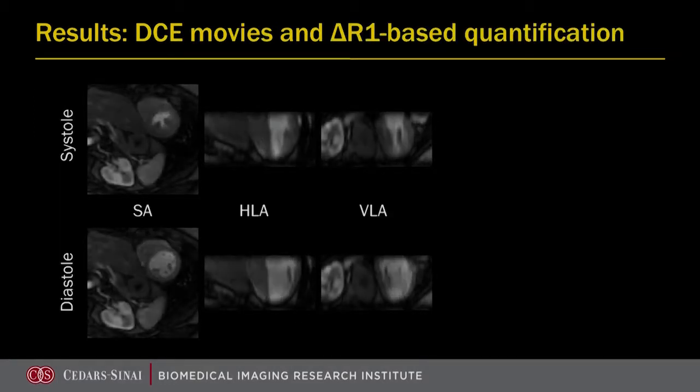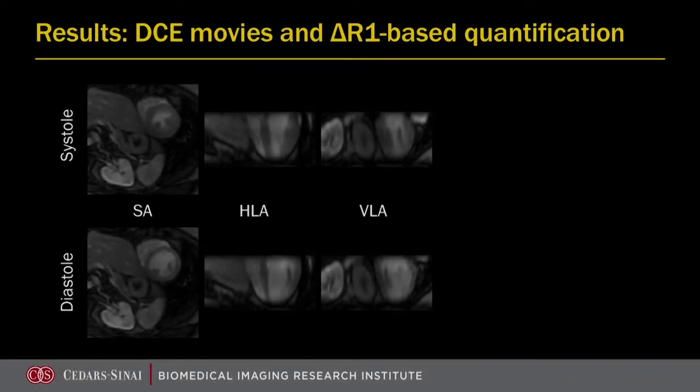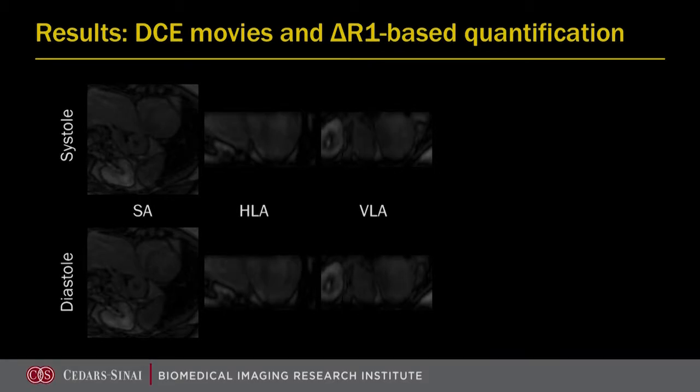And here's some actual movies from a different subject showing both systole and diastole for different views here, actually watching the perfusion process occur.